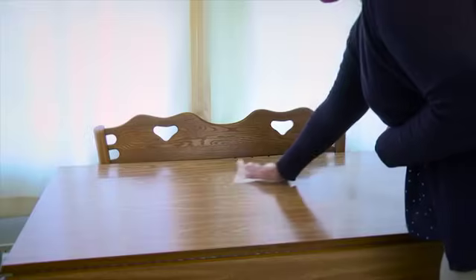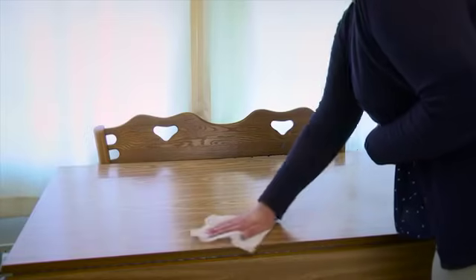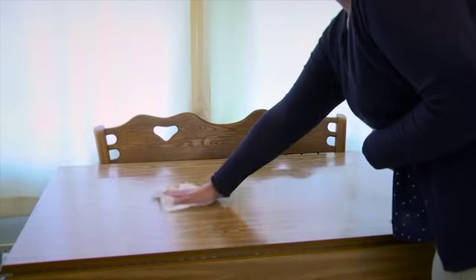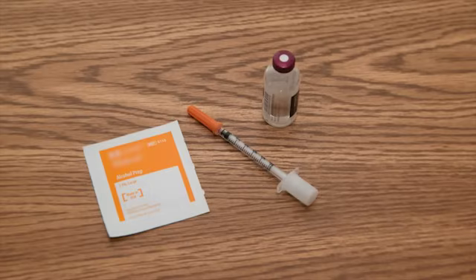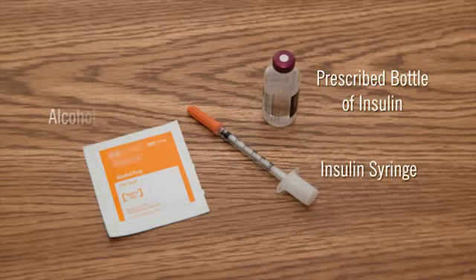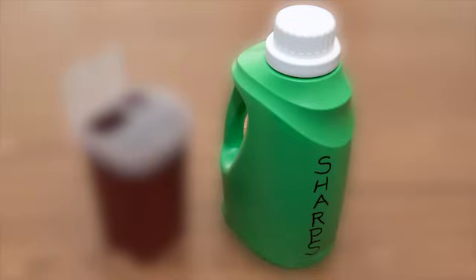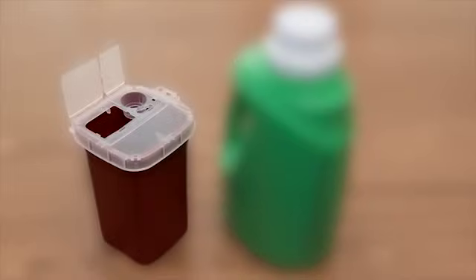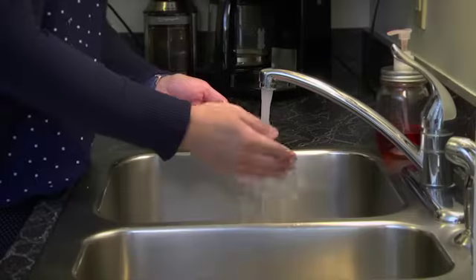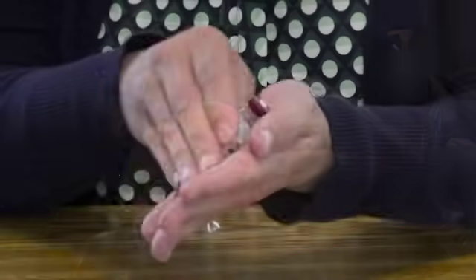Here are the steps you will take. Select a clean, dry work area. The supplies you will need include the prescribed bottle of insulin, an insulin syringe, alcohol wipes, and a container for used equipment. You can use a hard plastic container with a screw-on or tight lid, or a commercial sharps container.